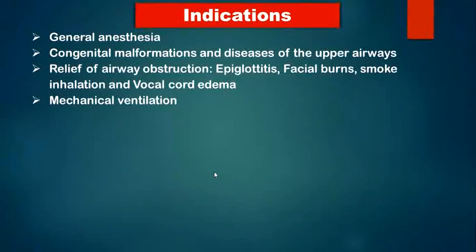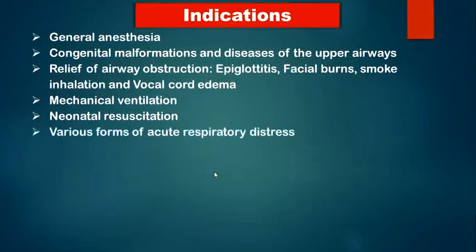Of course, you should intubate him. Neonatal resuscitation, you know, from which point the endotracheal intubation is considered, you should know it. And various forms of acute respiratory distress, whatever the cause. When the patient has a severe acute respiratory distress and cannot maintain the normal saturation or the normal breathing, he may be in need of intubation.